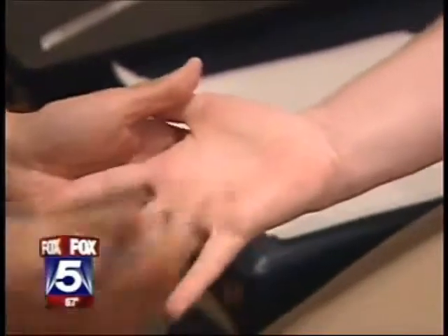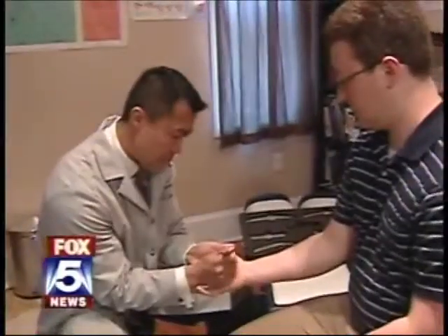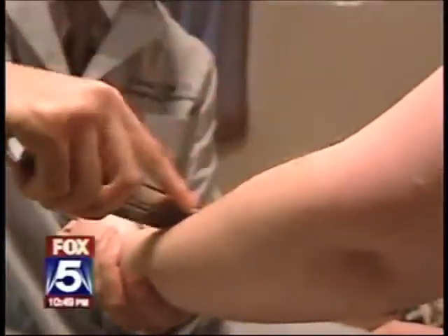Go ahead and open up your hands for me. Good. Now relax them. Dr. Ng says the tools help him detect where a buildup of scar tissue is restricting movement and causing the pain. You're able to find certain adhesions within the muscle tissue that you're unable to feel with your bare hands. You can actually feel a sandiness, a grittiness reverberate up to the tool.